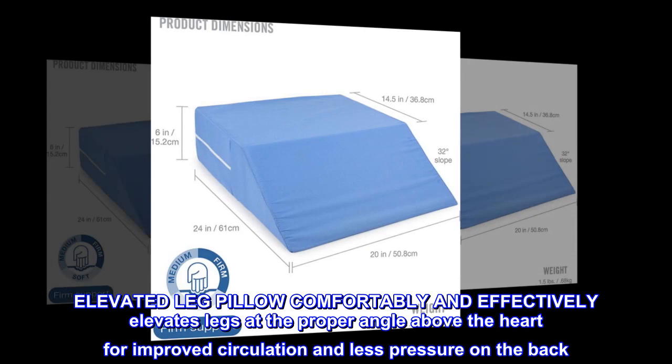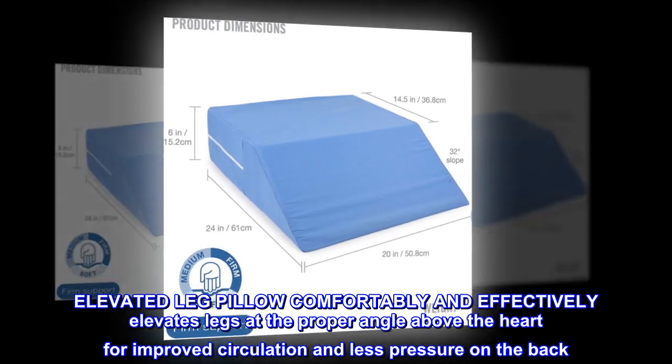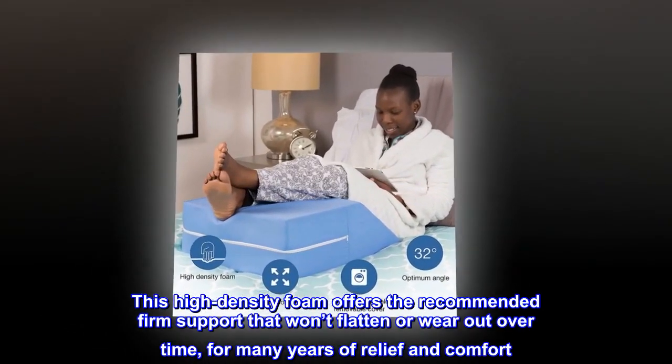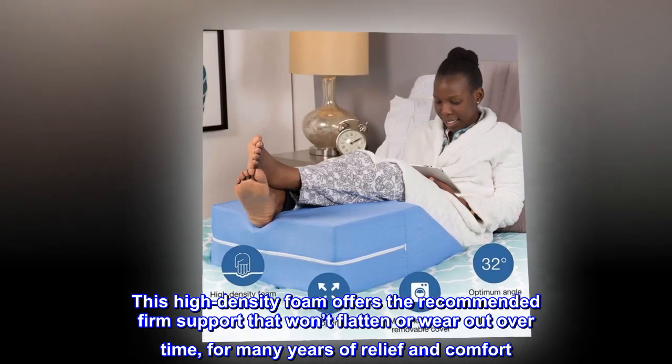Foam elevated leg pillow comfortably and effectively elevates legs at the proper angle above the heart for improved circulation and less pressure on the back. The firm supportive foam wedge pillow keeps its shape. This high-density foam offers the recommended firm support that won't flatten or wear out over time, for many years of relief and comfort.